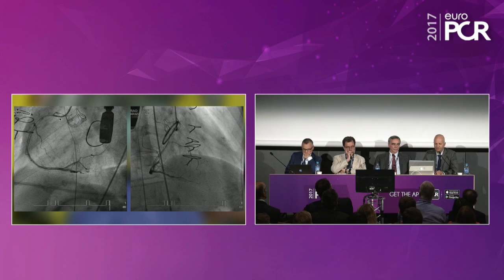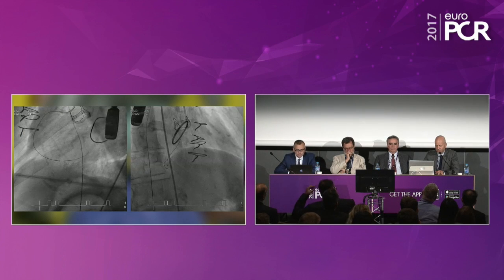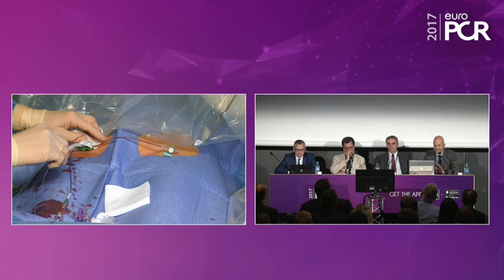Here you can see that we have always a catheter in the right coronary artery and also a wire, because it's a very important and very convenient landmark, which makes the procedure even easier because you know exactly where you are. It gives you really a nice orientation. And this is the en-face view. So here you would find the tricuspid valve. And here, this is the perpendicular view. This is the plane. Here is the right ventricle, and here is the right atrium. So fluoroscopy is also very, very important here, and you don't always have to rely completely on echo.